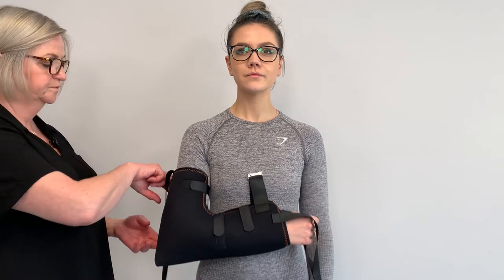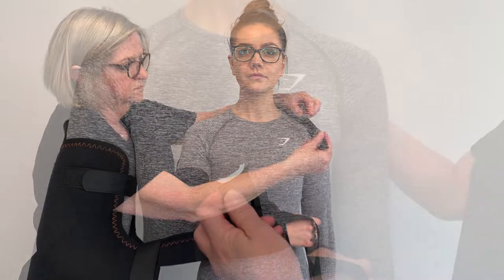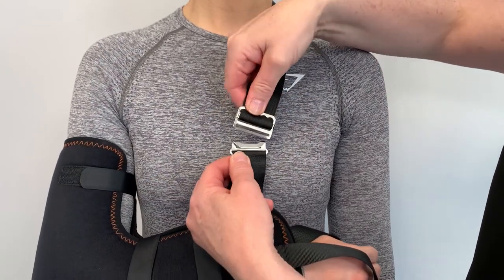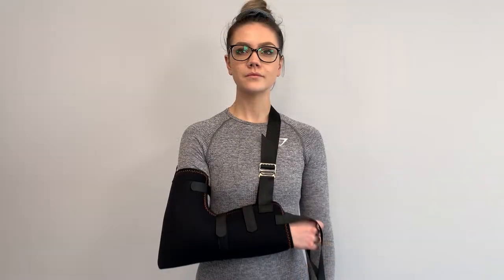The brace can also be used as a high arm sling by running the shoulder strap up from the injured elbow, take it around the neck and over the uninjured shoulder, and attach to the clip on the top of the sling.